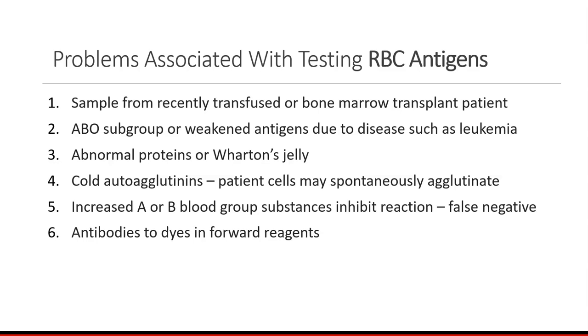In bone marrow transplants, we can cross ABO types. Let's say we give a group A transplant to a group O person. In fact, this is really good news, when you can start detecting those A cells, that means the graft is successful. So what will happen is you will get a sea of free cells, which are the patient's group O cells, with a tiny population of group A cells that will be a button. So again, mixed field agglutination will occur.